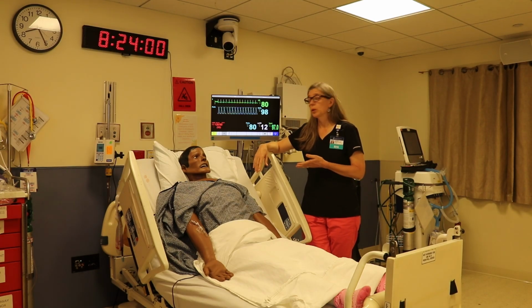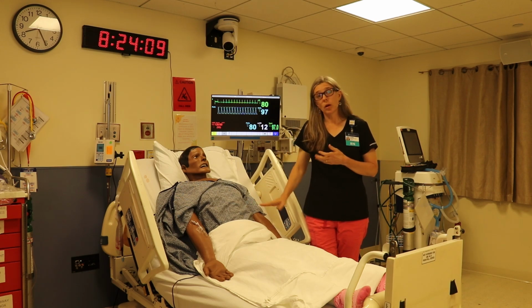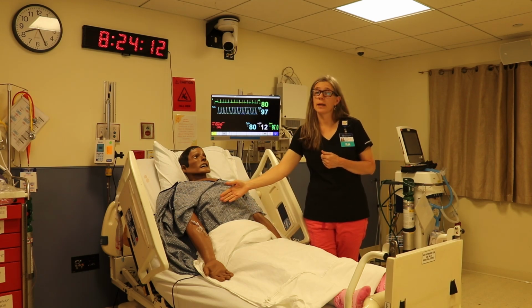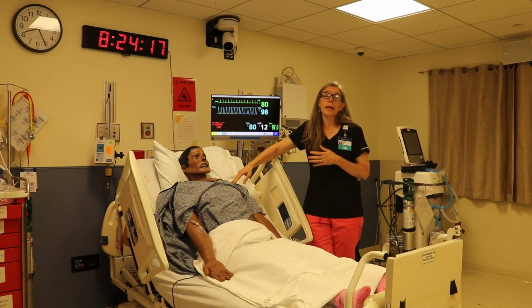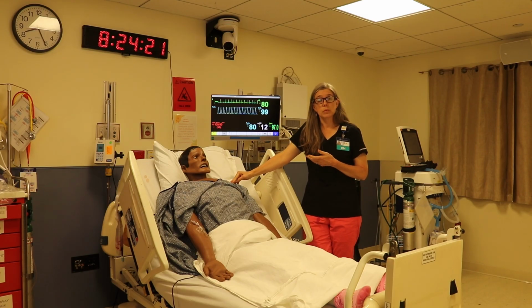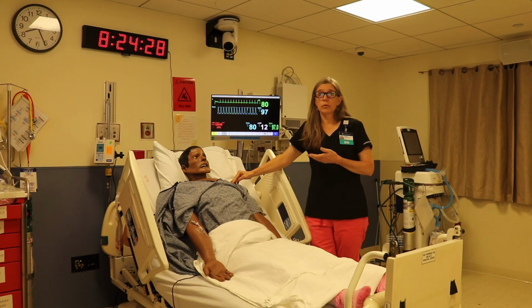This mannequin can open and close its eyes. It has chest rise and fall that mimics breathing and has lung sounds that can be auscultated using a stethoscope. It has palpable pulses in all the places you would normally feel a pulse, and it has a working IV. It can make coughing, crying, and screaming noises, and can demonstrate seizure-like activity. The mannequin can also talk to you in response to any questions you may ask it to provide you additional information. The mannequin can be defibrillated, cardioverted, or paced using the LifePak, which we'll review in a subsequent video.